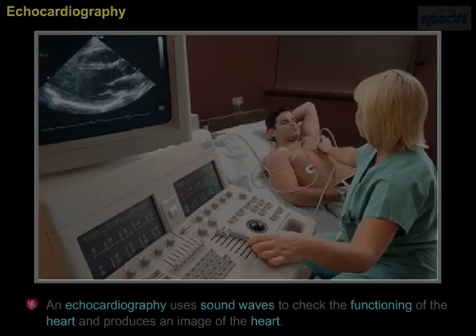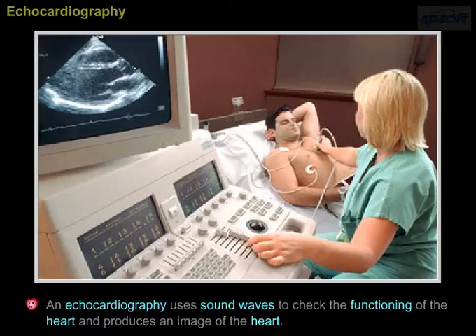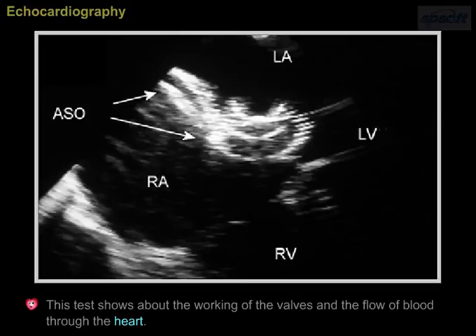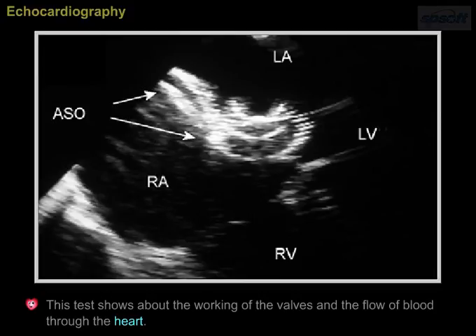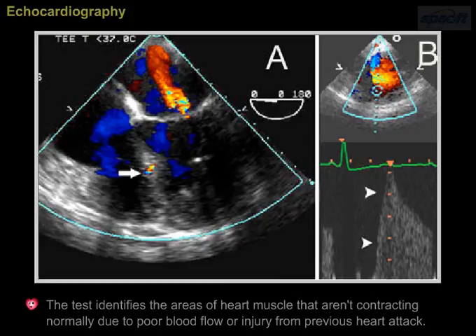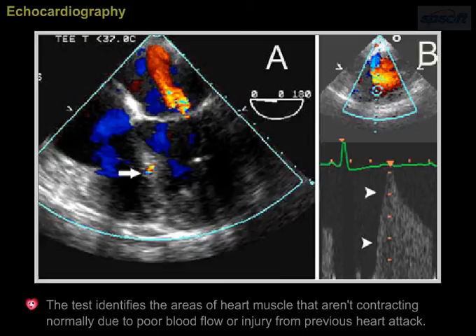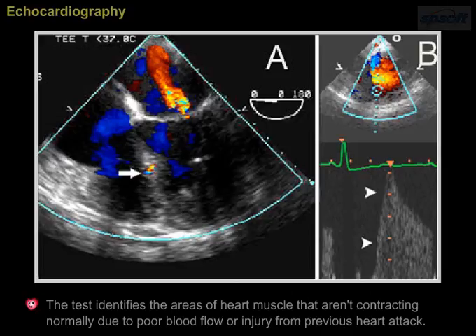Echocardiography uses sound waves to check the functioning of the heart and produces an image of the heart. This test shows the working of the valves and the flow of blood through the heart. The test identifies areas of heart muscle that aren't contracting normally due to poor blood flow or injury from a previous heart attack.